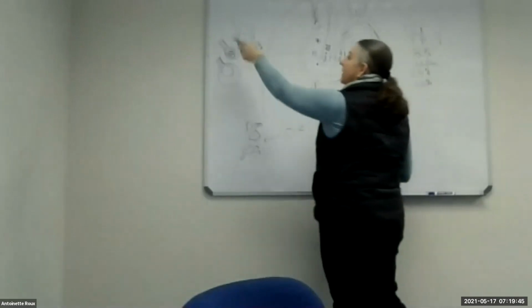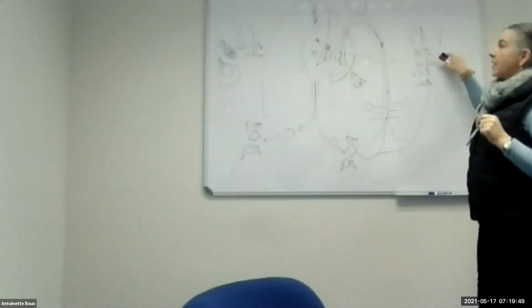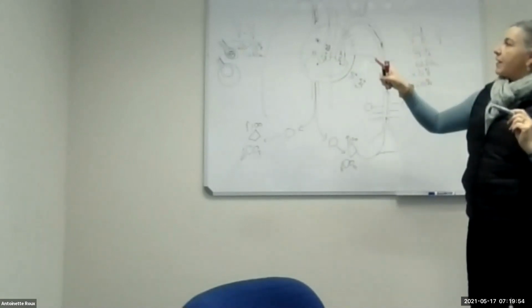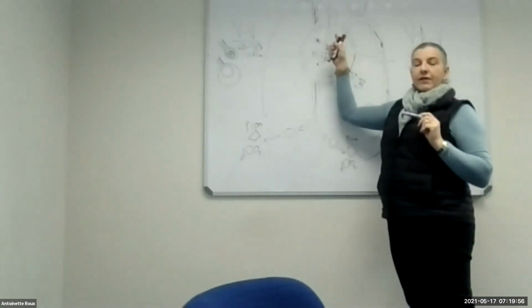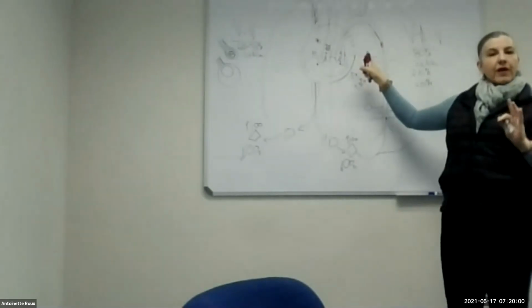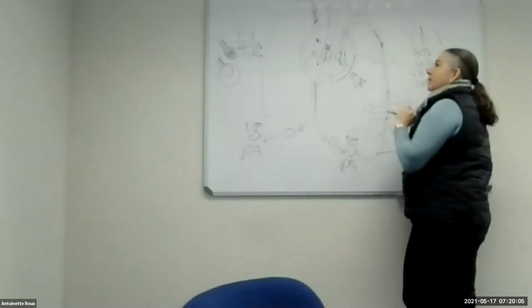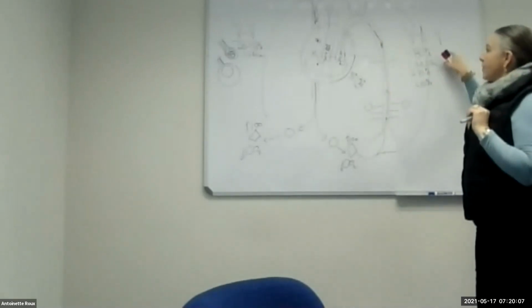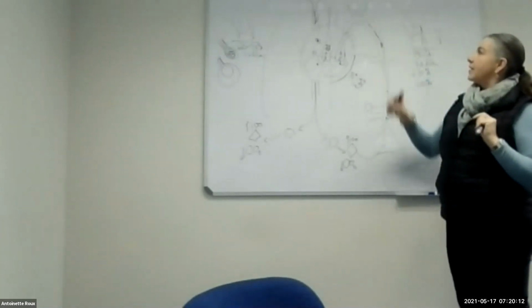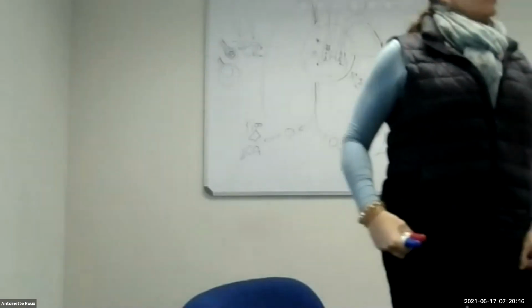VV ECMO is predominantly gas flow, and that's important, and VA ECMO is blood flow because we take care of some circulation on this side. If you're on VV ECMO, you need a perfectly functioning heart. Okay, so you're not supposed to be on high inotropes. Your heart must be able to contract properly because you need this heart to push the oxygenated blood forward. If you're on VA ECMO, we can flow a little bit higher so that we can get all the oxygenated blood in the right places. And that's it.